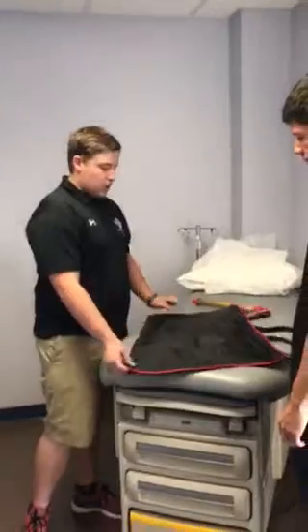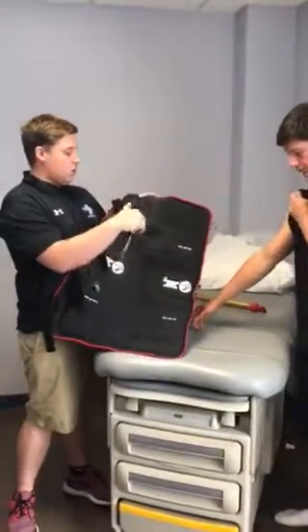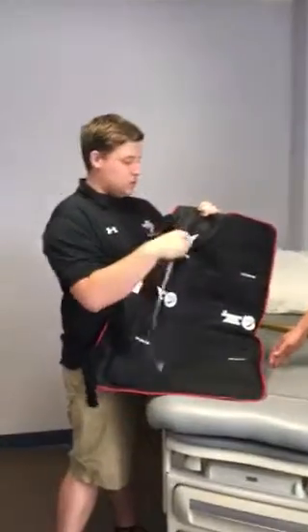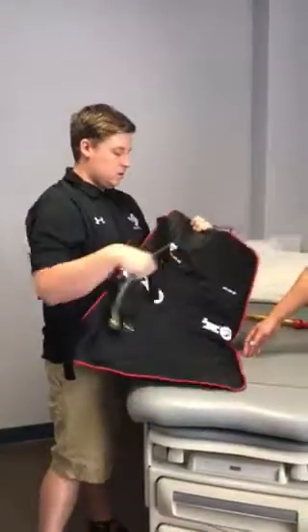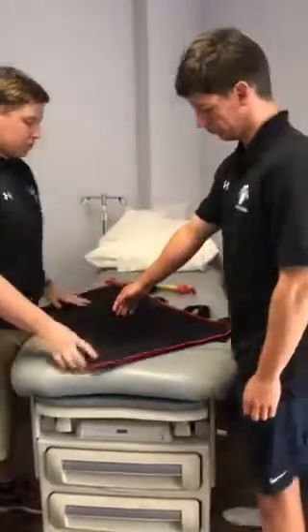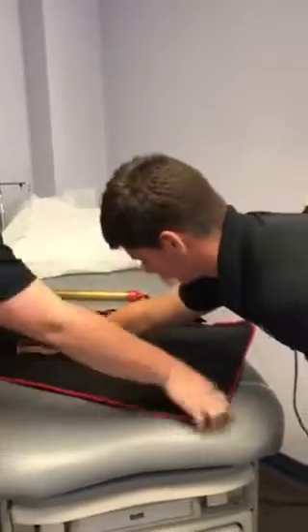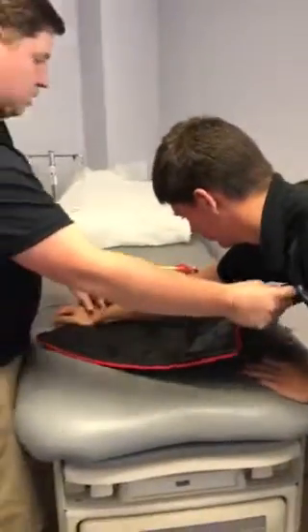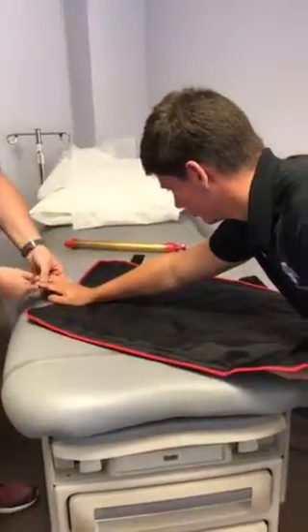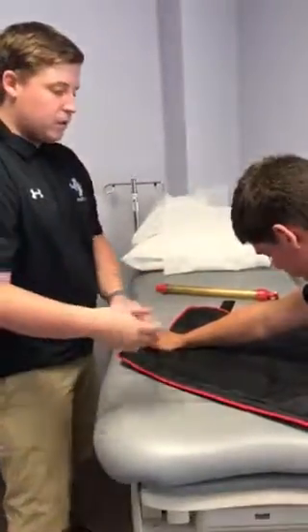As I'll show on Josh, this is what the splint looks like. It will come with a hose. Some may be attached, but this one comes separately. You attach it. You're going to want to make sure you put the bigger area towards the upper portion of the arm. If Josh has an elbow injury, you want to make sure his arm is in this splint. You want to make sure you can still see the fingertips so you can get capillary refill as well.